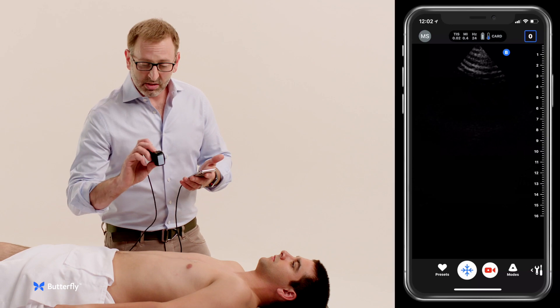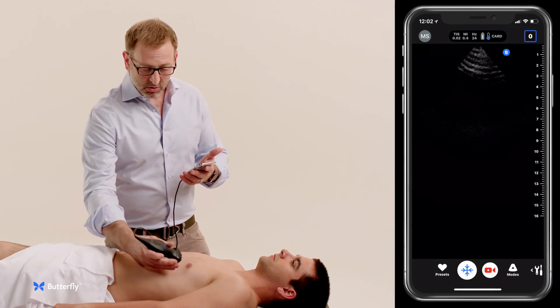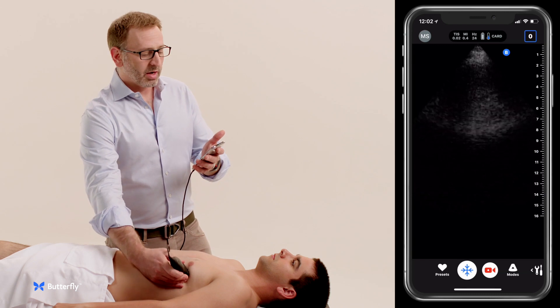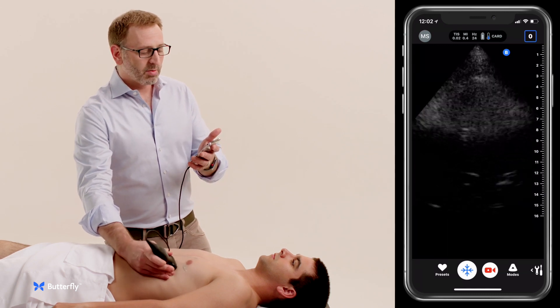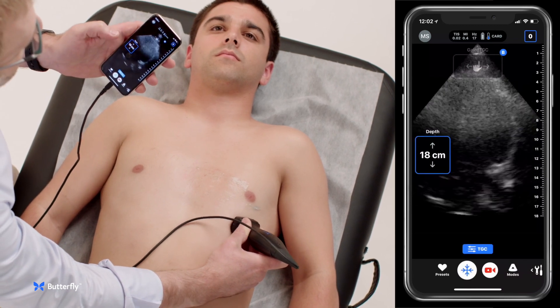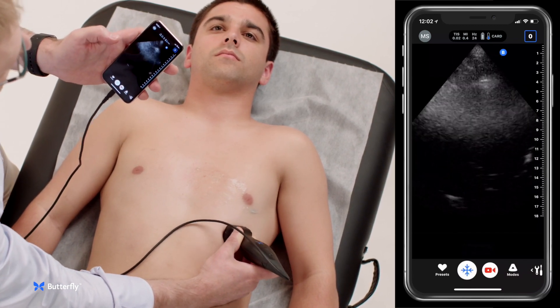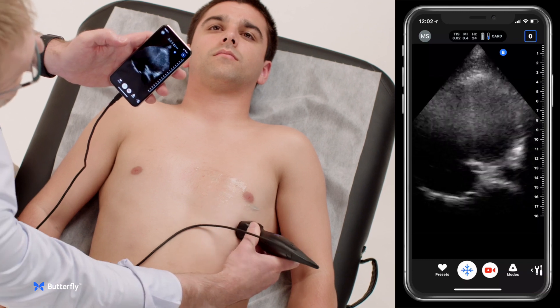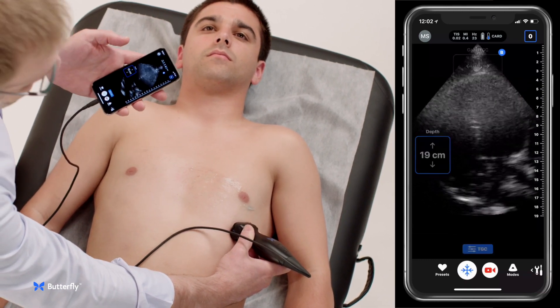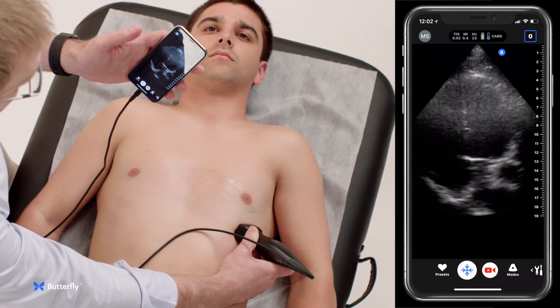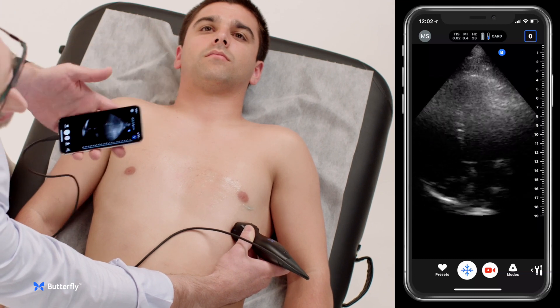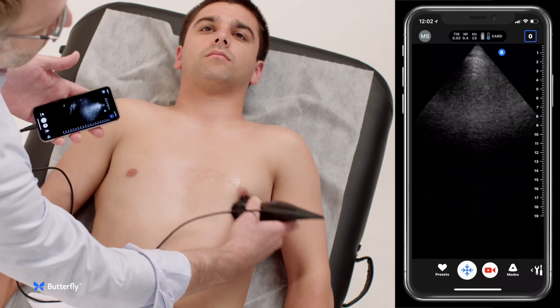From here we'll place the transducer with the indicator towards the bed, just under the nipple in the anterior axillary line, looking for an apical four-chamber view. This view can really be optimized if the patient is rolled into a decubitus position, but for a short-of-breath patient it's often challenging to lay them on their side right away. In this case we're able to look at LV and RV ratios and see that the LV is bigger than the RV, which is normal.